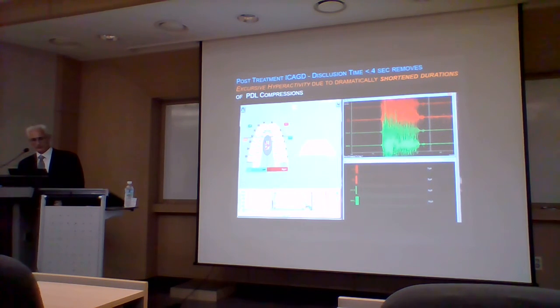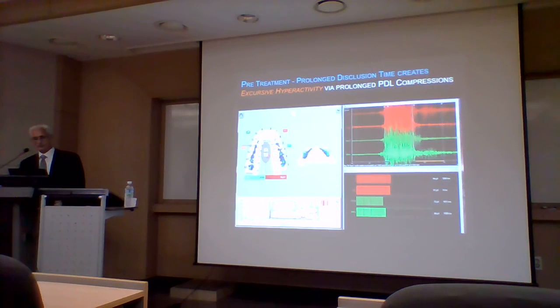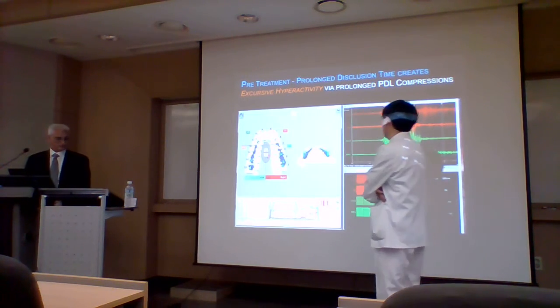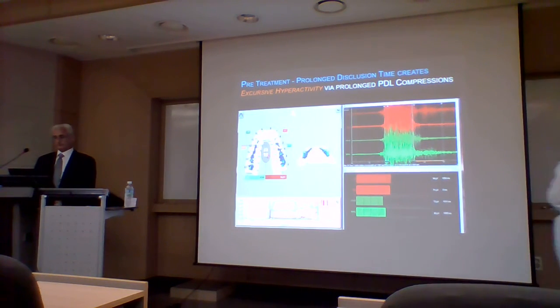So in here the disclusion time is less than 0.4 of a second. I think it's 0.34. And that's a good guideline to go by. Before treatment, the disclusion time is 1.34 seconds. 시간이 1.4초 정도 걸렸는데 바꾸고 난 다음에 보니까 1초 미만으로 줄었잖아요. 디스클루전 타임이.